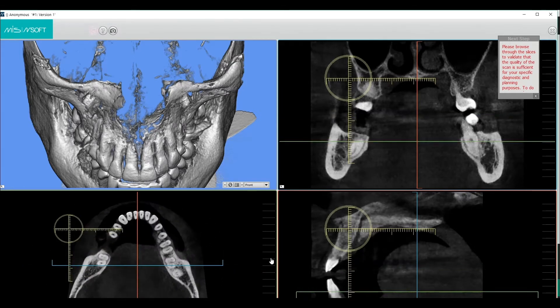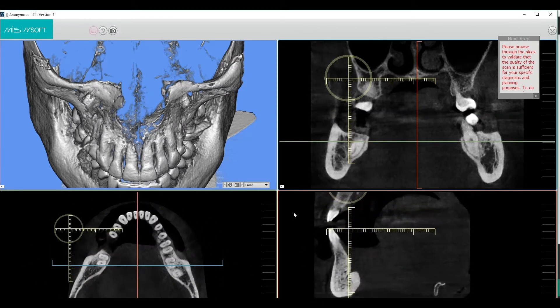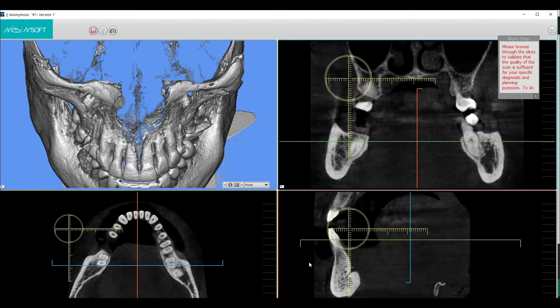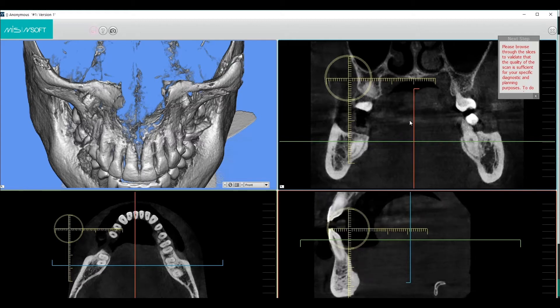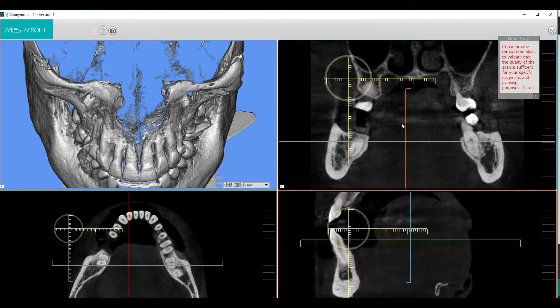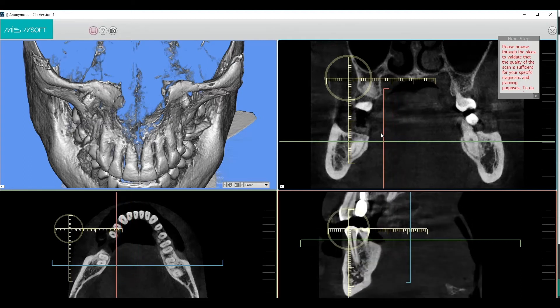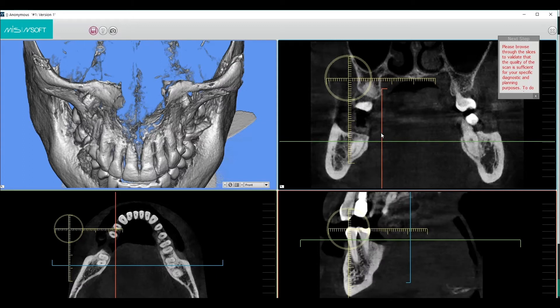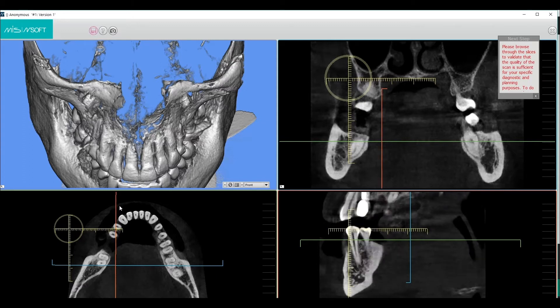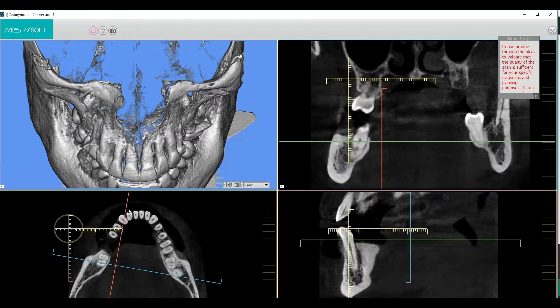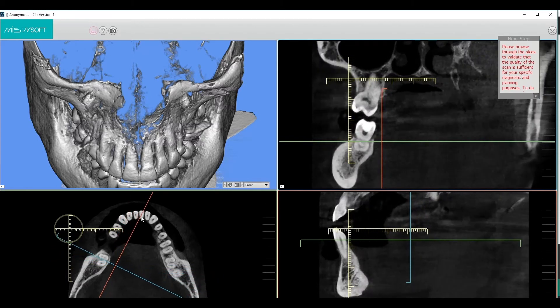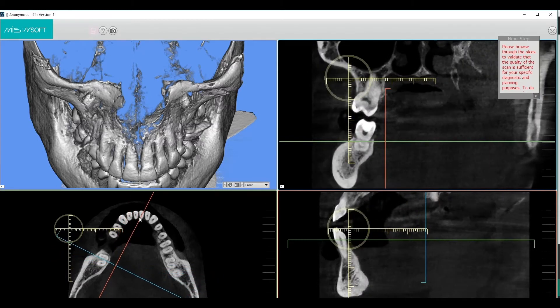Each 2D window will have two surfing planes. The color of the surfing planes will coincide with the frame color. Moving a surfing plane in one of the 2D views will move the plane in the other 2D windows correspondingly.